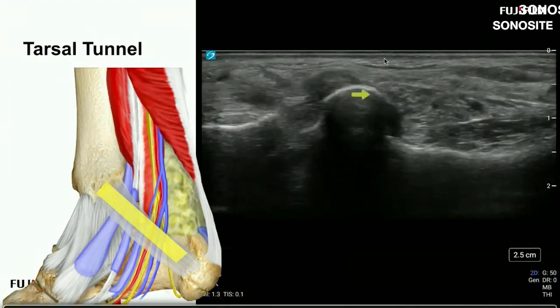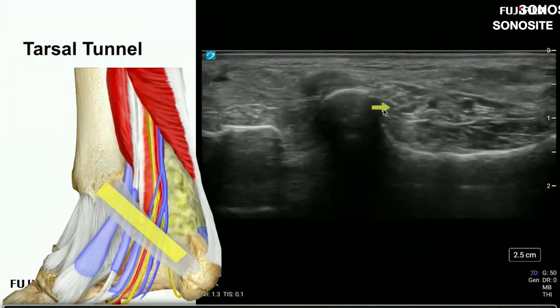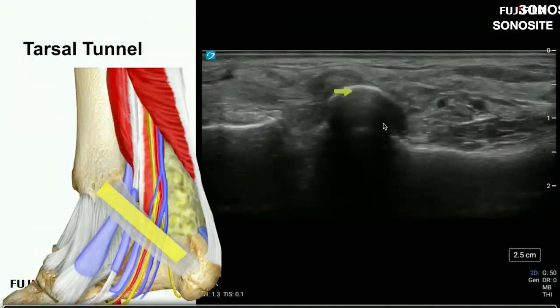We're going to wiggle the big toe, so you can see that shadow right up against the neck of that sustentaculum tali, and start moving the big toe. And we'll do that in a live scan. It'll look much like this because it's the same model.